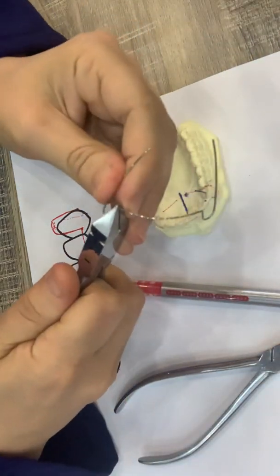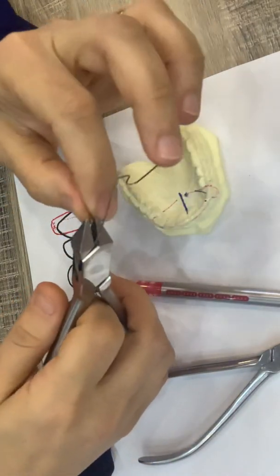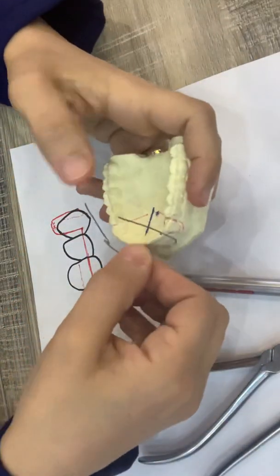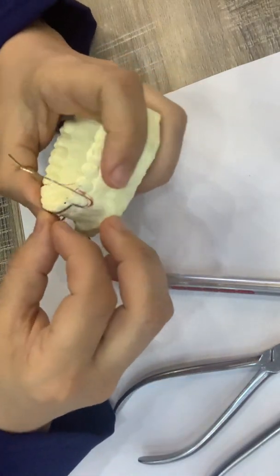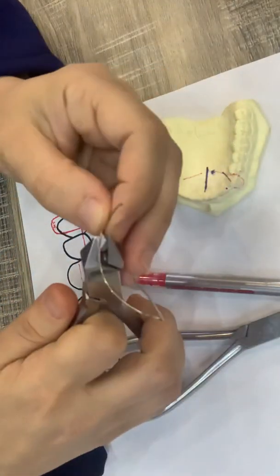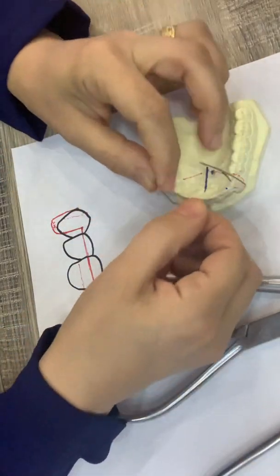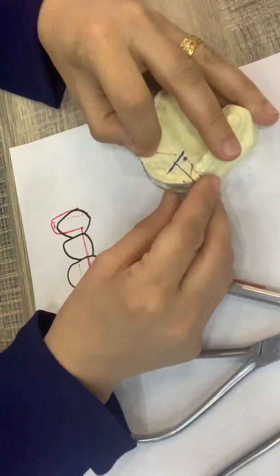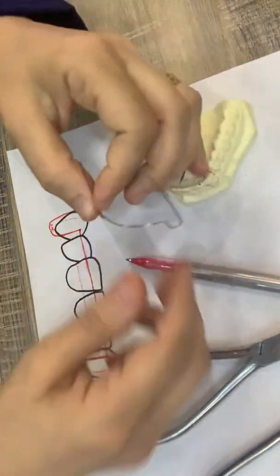So we grasp the U-loop and bend the wire toward the contact area, until it reaches the contact. Okay.